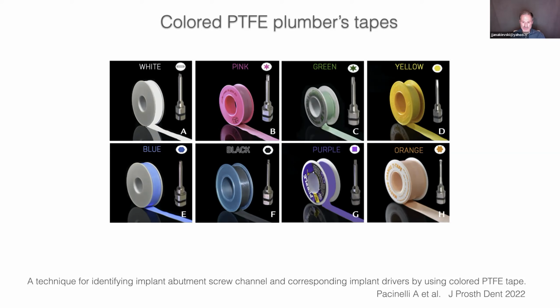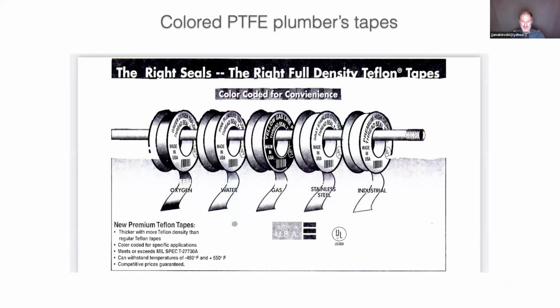And so, we as clinicians have started to propose all these different applications of plumber's tape, including these colored plumber's tapes. But there's very little that we understand about this when we're making these proposals. So let me tell you what we know about how plumber's tape is manufactured. Our understanding of colored plumber's tapes goes beyond what we feel emotionally about it, or how we want to apply it, like in the previous article, to represent certain screw channels or screw heads.